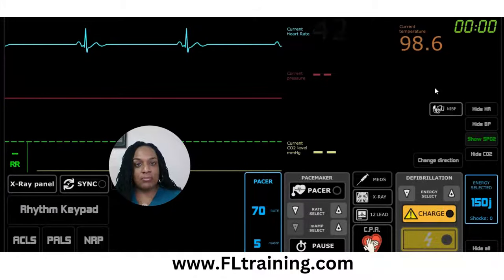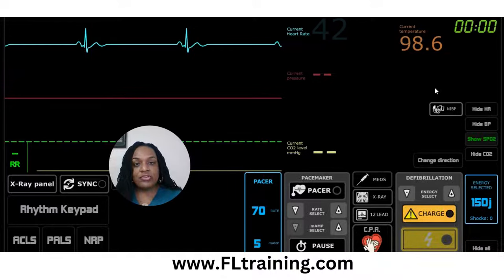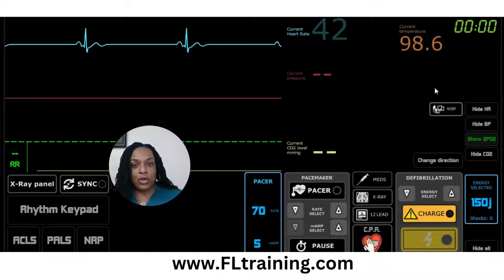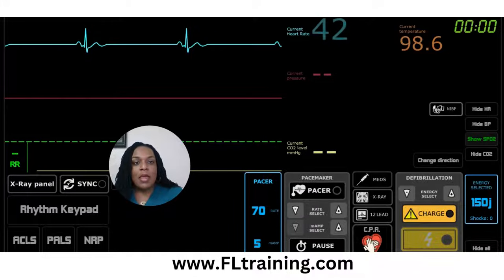So if a patient is symptomatic — they could be short of breath, dizzy, having blood pressure issues — and has a heart rate less than 50, we're going to treat. So I'm going to go ahead and start our scenario.